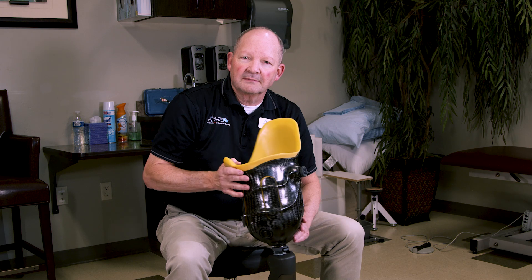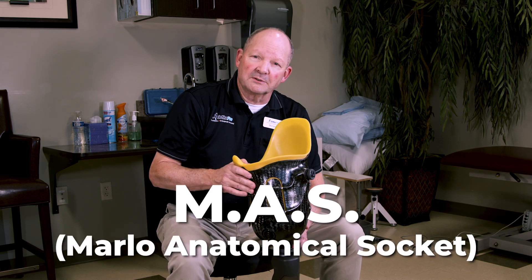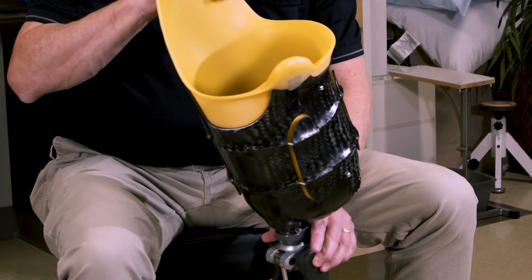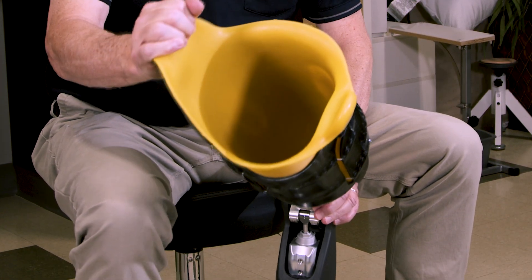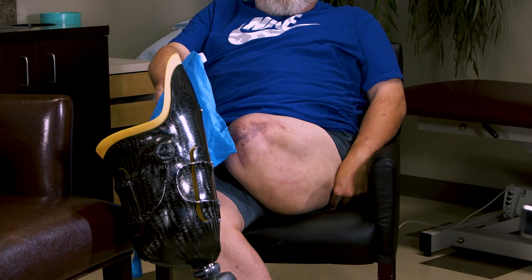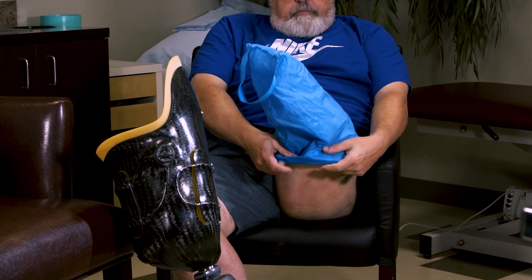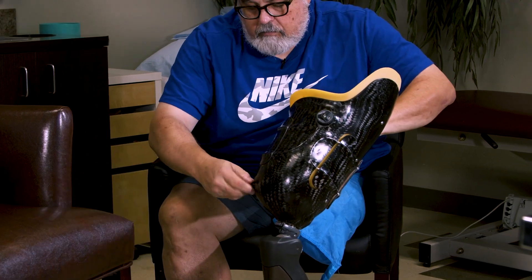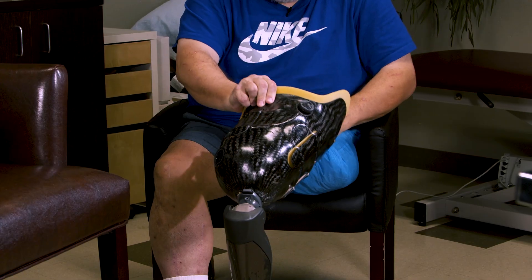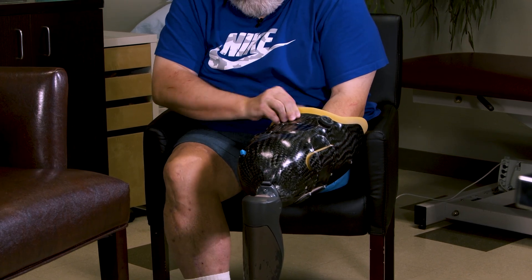This is what's known as a MOS socket or a Marlowe anatomical socket, and it has a flexible inner liner. This is designed to be a skin fit liner so there's not a roll-on silicone liner that the patient has to put on. They actually pull into this with a donning bag and it exits out of a valve here. This valve expulses any air and creates a suction socket fit.